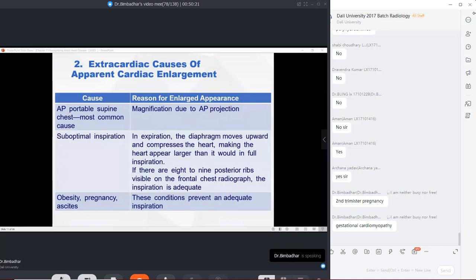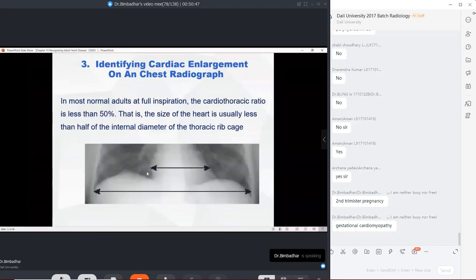But in special conditions we do not use it because of ethical situations, because we do not want to cause unwanted mutations in the fetus. Okay, but there are some exclusive conditions. Yes, for some people we will be doing the radiograph itself. I will show you an example in which we actually do radiographs in pregnant ladies.